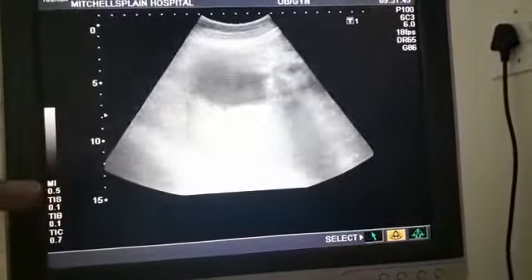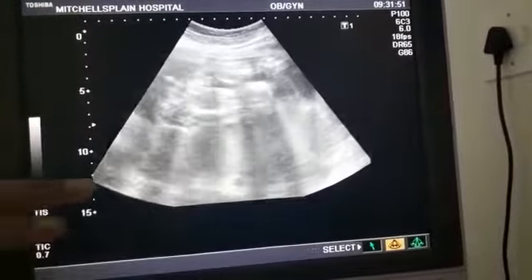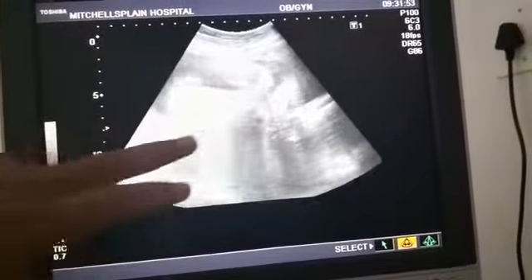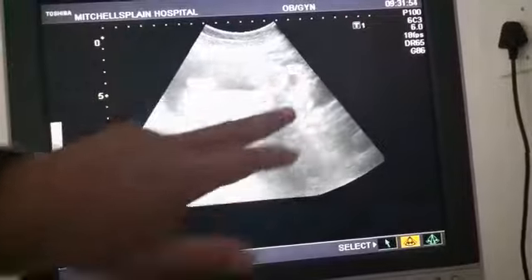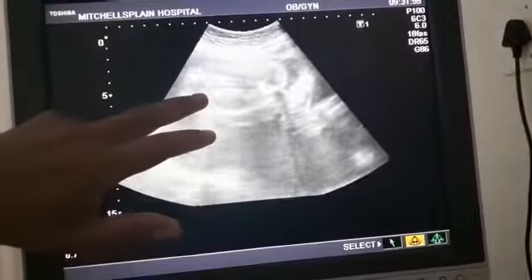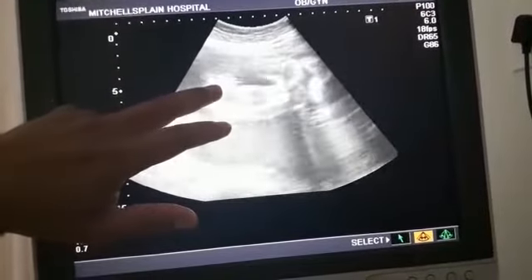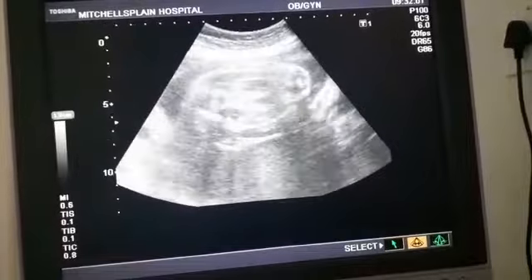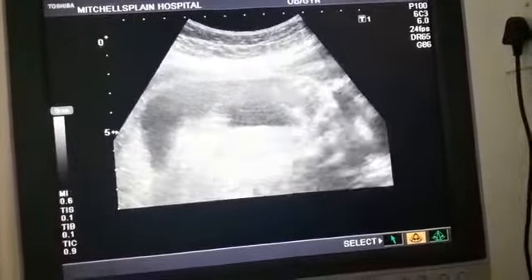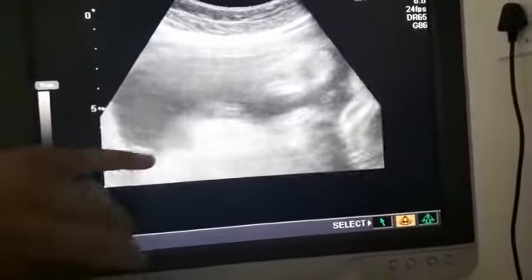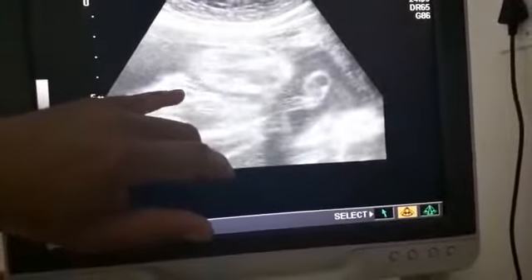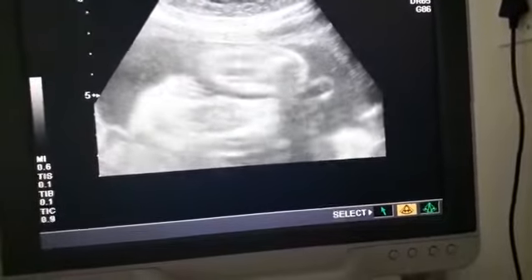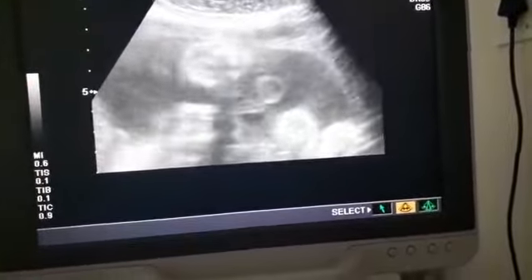There's the other leg coming like that. Now we're looking at the two thighs — that's the one thigh, that's the other thigh. And that area there, between the legs, we call it the hamburger sign, because it looks like two rolls with a patty in the middle. That's a baby girl! Well done.